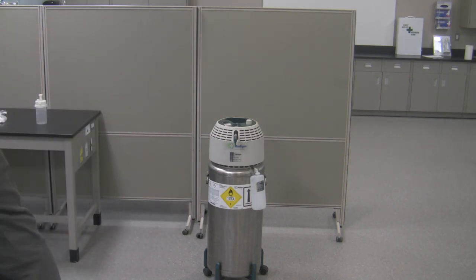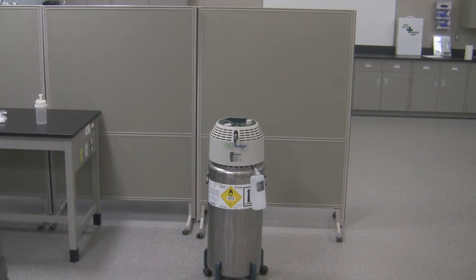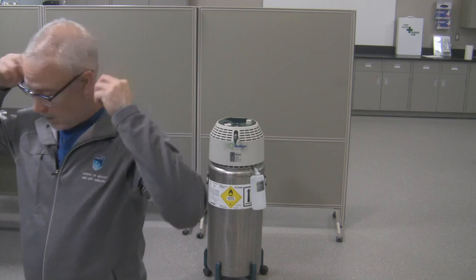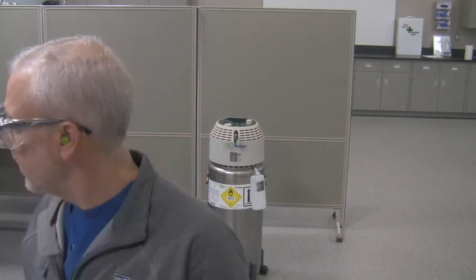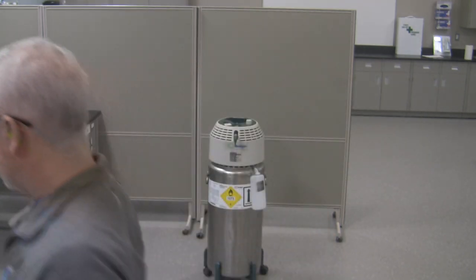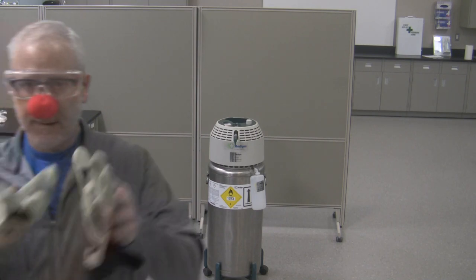Let's put our safety stuff on. I'm going to put the ear protection in. I don't have a full face shield here so I'm going to use safety glasses — these go right over top of my glasses. And to protect my nose, you should always make sure you're wearing a clown nose. And I've got my gloves on.